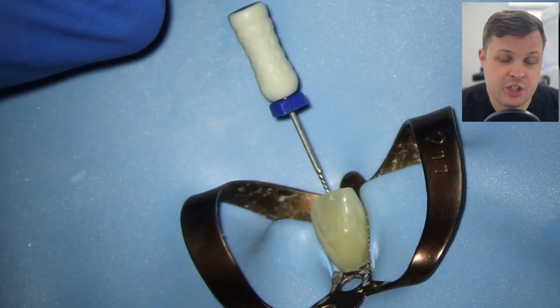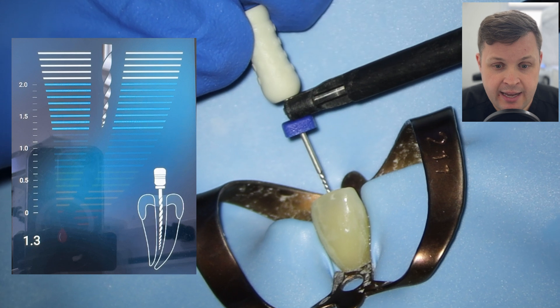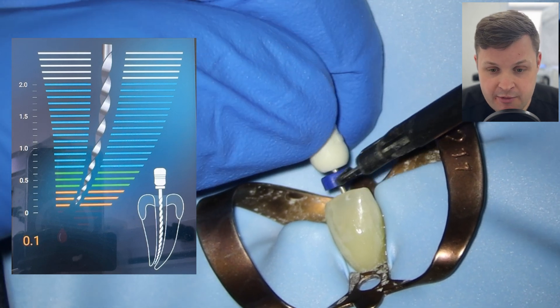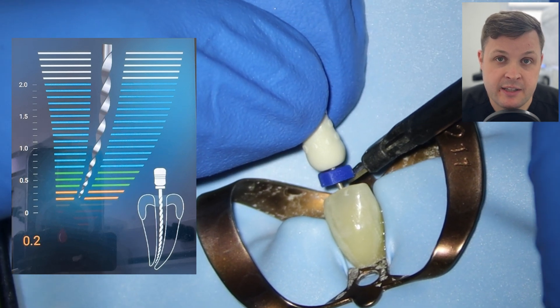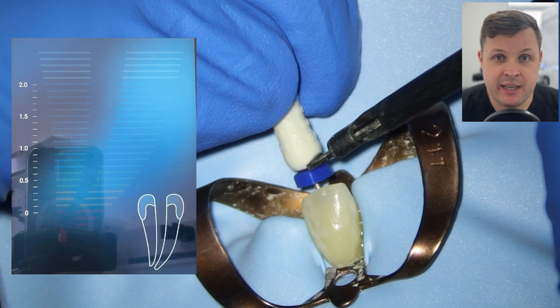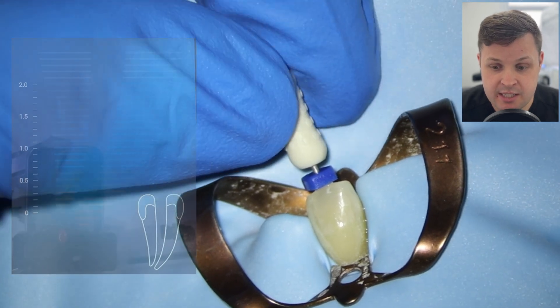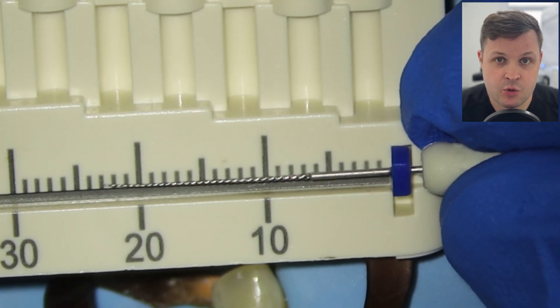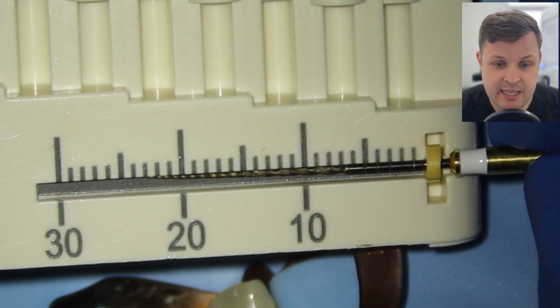We're ready to do our working length measurements. I'm using a size 15 K-file — arguably the most accurate file to gain a correct working length. I'm using a very gentle watch-winding motion down to zero. What I like to do is very gently push the file just a tiny bit past the apex, then back it up, and as it reaches zero that is my correct zero reading. When we pull the size 15 K-file out and measure it, the zero reading is 23 millimeters.